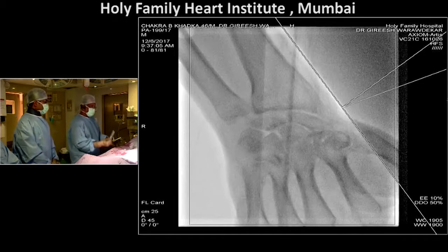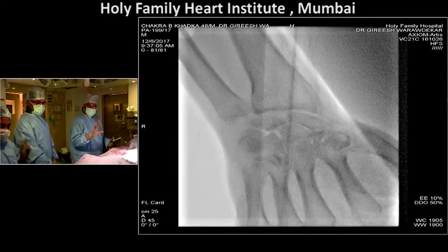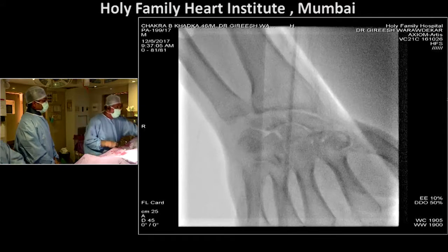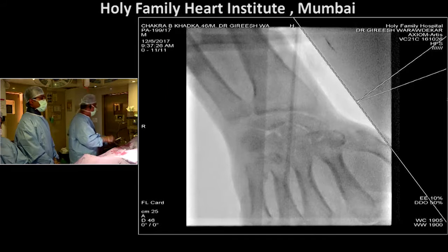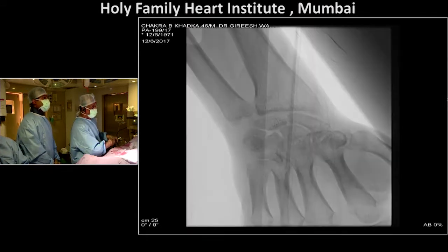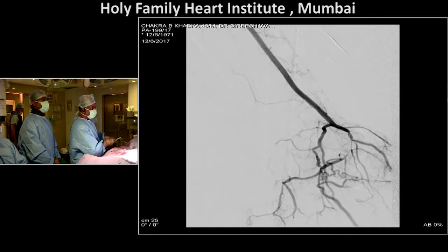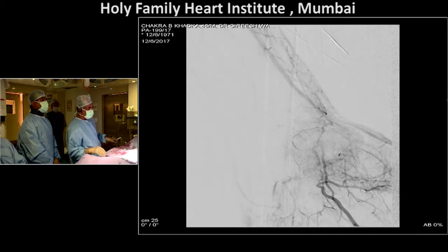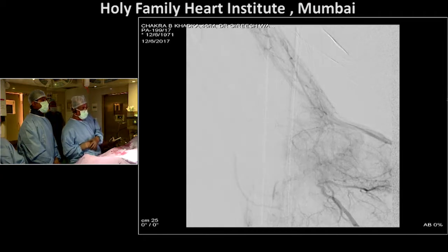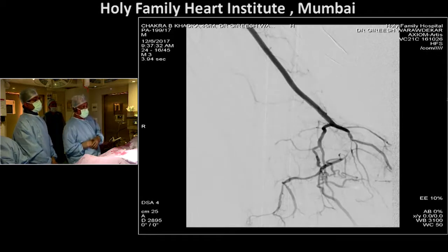I think I'll take this last shoot. Yes. We are all anxious to see what is happening to the arch there. Very nice, Gireesh. That's really bright and good, and looks really good. I'm sure all of you appreciate that the flow is definitely much better and much faster now.